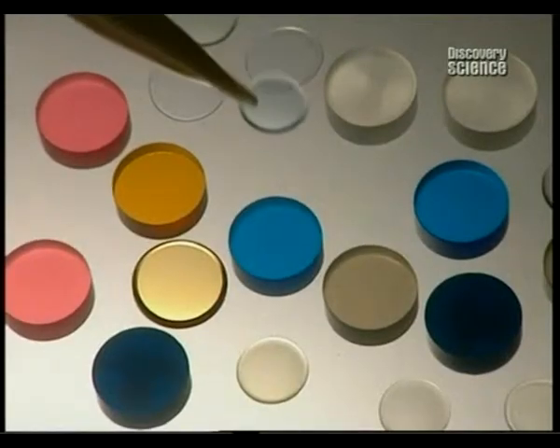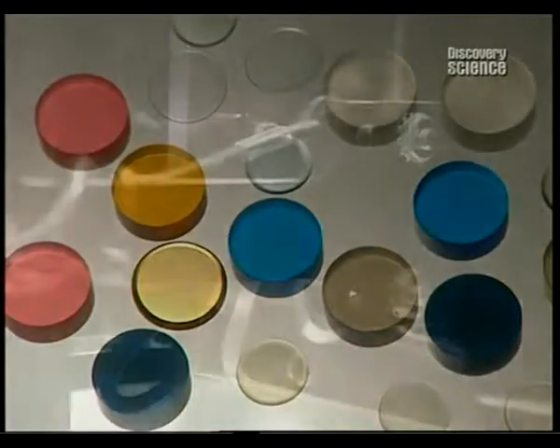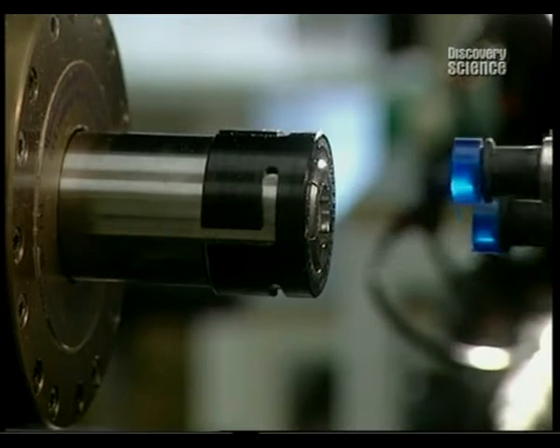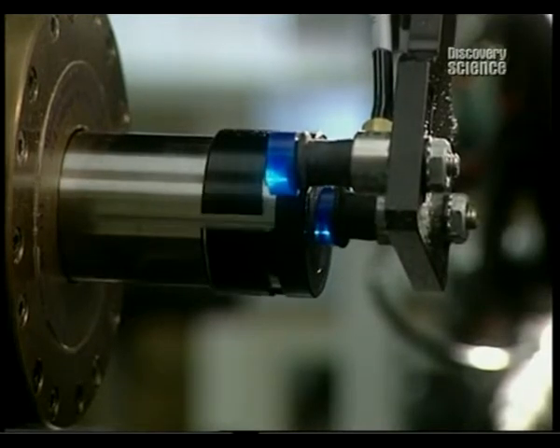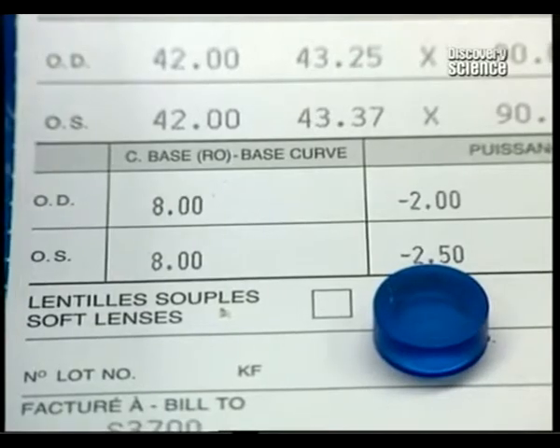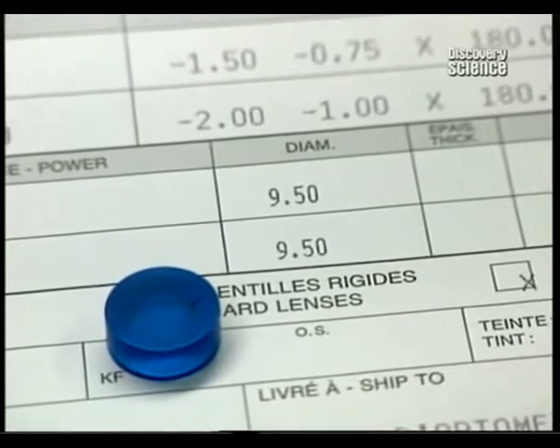Contact lenses have been in existence for over a century. At first completely rigid, they have become as flexible as gelatine. These small discs are used to make soft polymer contact lenses in a variety of colours. Of course the place to start is with a patient's prescription, which has been digitized for the process to begin.